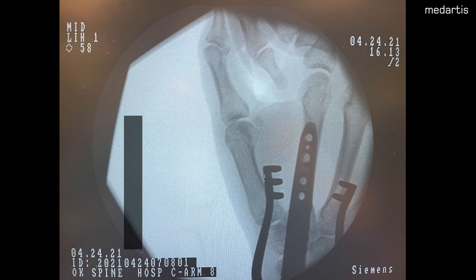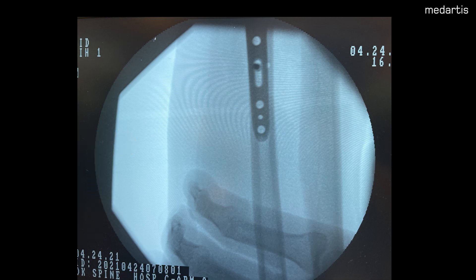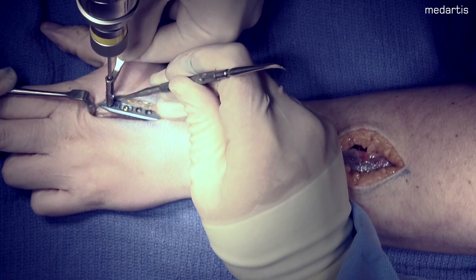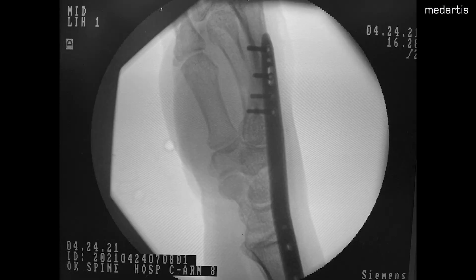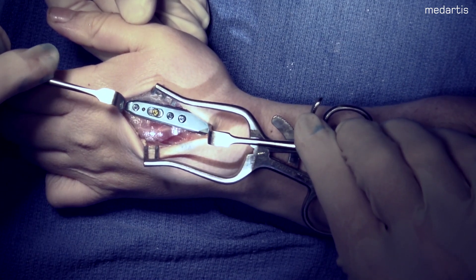I first fix distally with one cortical screw in the oblong hole on the second metacarpal. Then proximally, a cortical screw is placed in the most distal aspect of the oblong hole. Care is taken to ensure a neutral position of the forearm in order to avoid malreduction of the fracture. Traction is applied as needed. After securing the reduction and placement of the plate, drilling and filling distally on the metacarpal and proximally over the radius is performed. Here you can see we are underneath the second dorsal compartment sitting nicely on the radius surface with minimal soft tissue stripping.